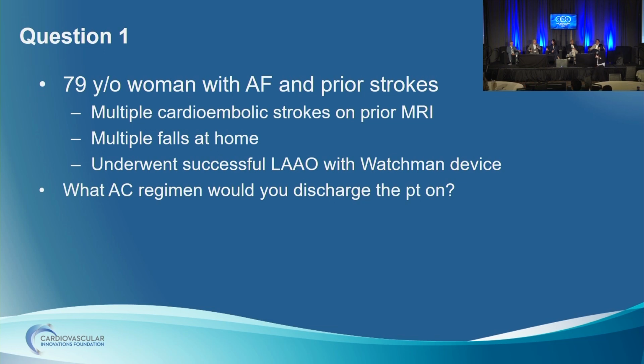It's our practice, we switch everyone to DAPT at the time of implant, and that's across the board with all of our implants. And I know that we have an incidence of DRT of around 0.59%. We just actually looked at this for SCAI in coming up with guidelines, and there's really little data to support the use of 6 weeks of oral anticoagulant therapy. When you look at the data, it really doesn't support that. So I think that the guidelines are going to reflect that in the new guidelines.